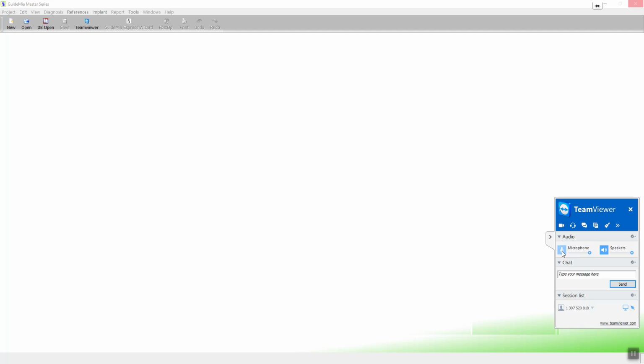Hi, Brian, can you hear me? We're still here. What's up? Did you say you want us to print this guide, or you want us to adjust the planning and do another printing? No. We'll do our own and print from that. Okay. Because again, as I was explaining, we wouldn't plan one kind of guide and then plan another kind of guide. We normally just do one in a case. All right, I see.